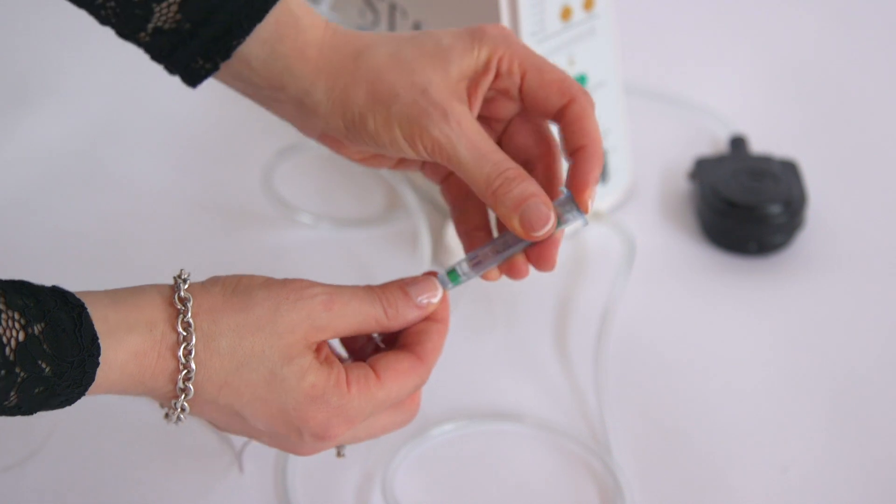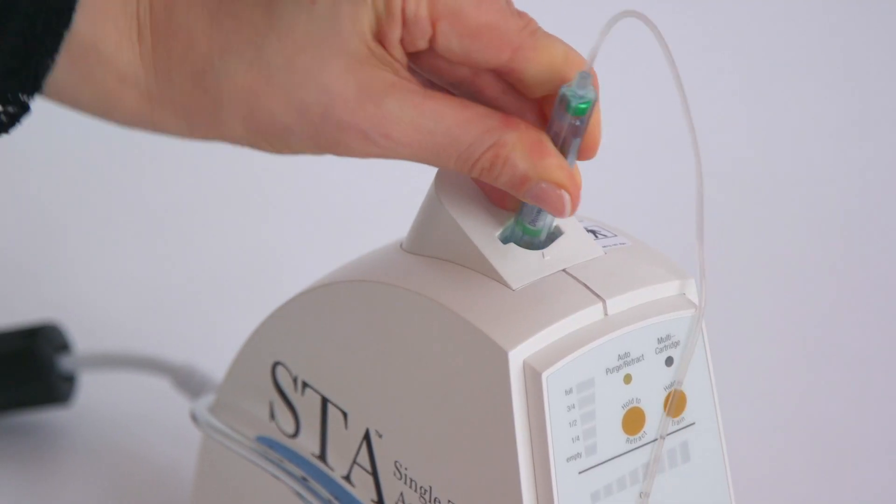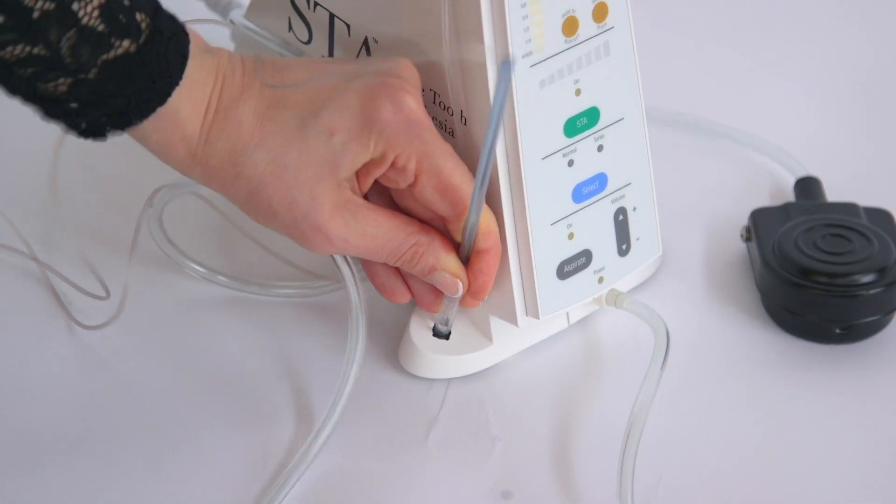Let's see how it works. After selecting the anesthetic, you just have to fix the handpiece to the machine, like this.